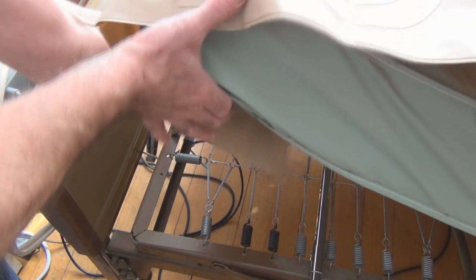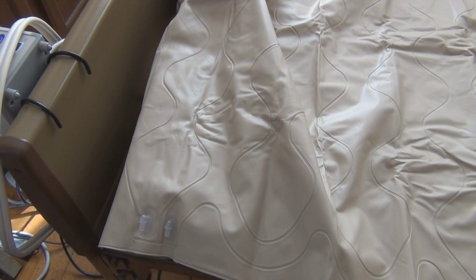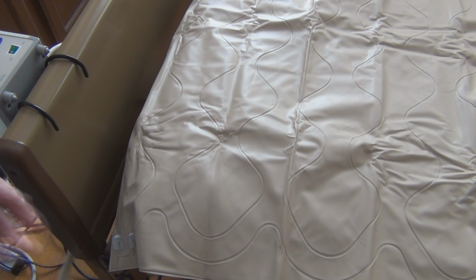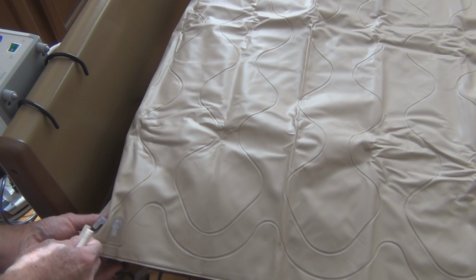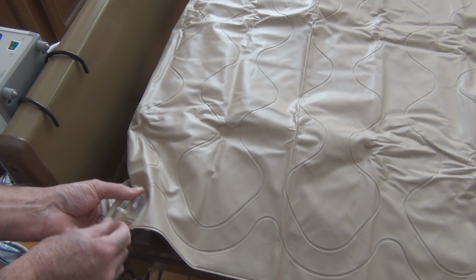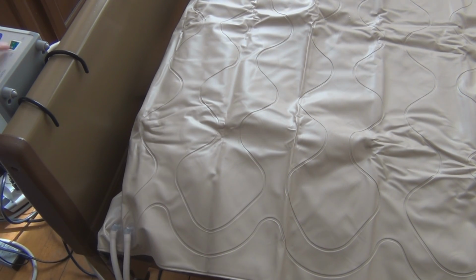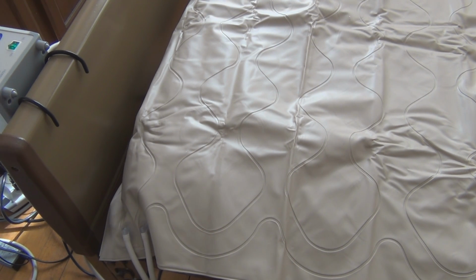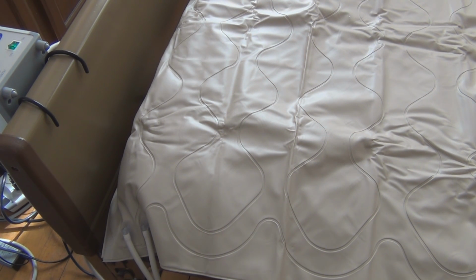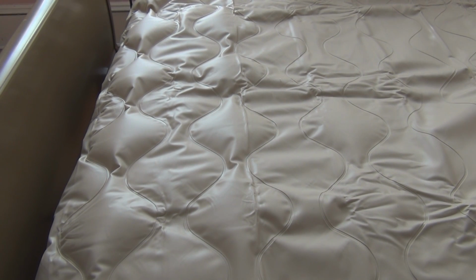So tuck the flap underneath on both ends. This actually seems kind of wider or longer. So there's no order to this. Just put them on here. When one's inflating, the other one's deflating, and vice versa. So turn the pump on. And you can see it's starting to inflate. You can see this chamber here and this one have already inflated. It's going to take a while.